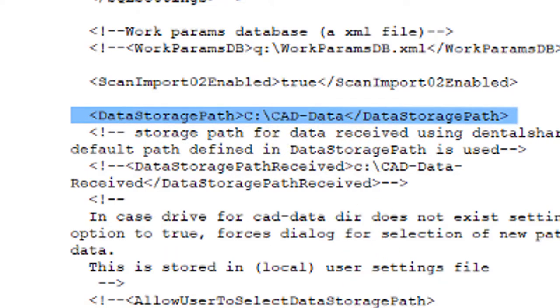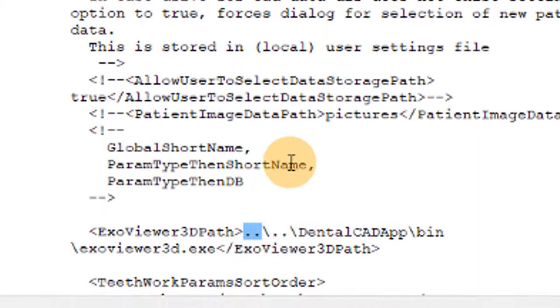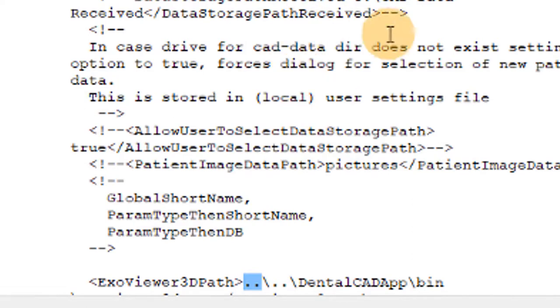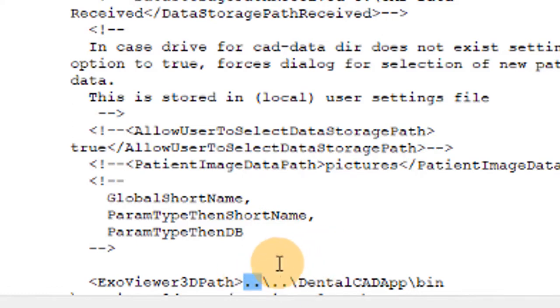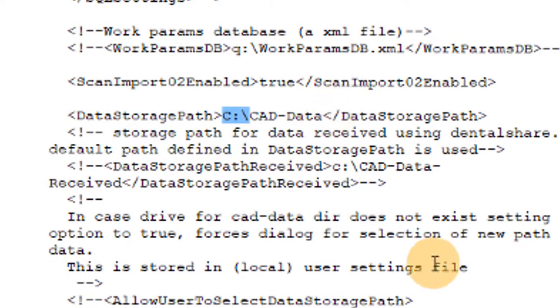So that means the dot dot like you see down here means the ExoCad installation folder. So whatever folder you have put that in, whatever folder dental DB is in, that's what the dot dot represents, period period slash. So I just change that to the C drive C slash CAD dash data. So now all of my data gets put in that C drive folder instead of this specific ExoCad version folder.